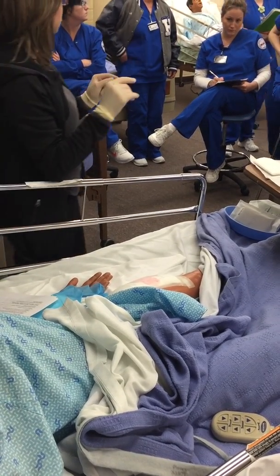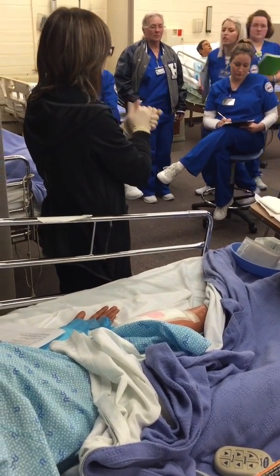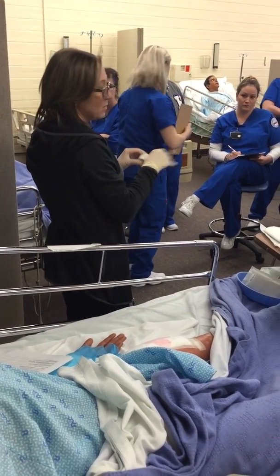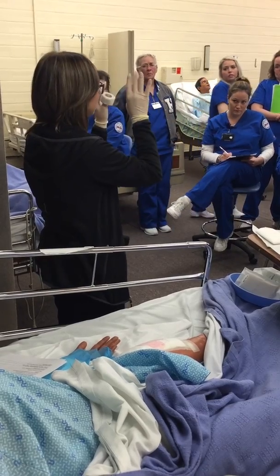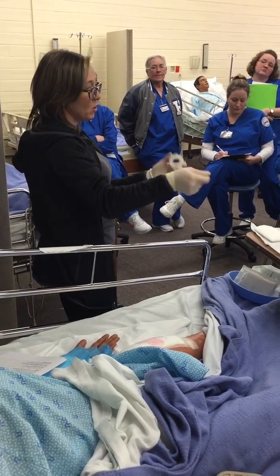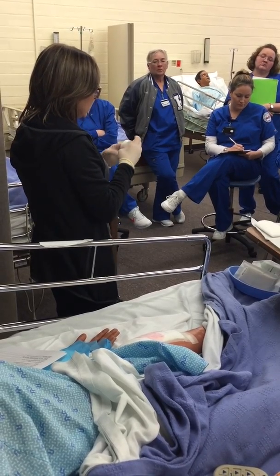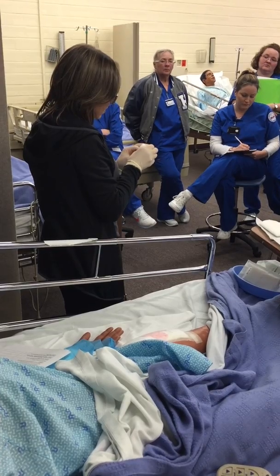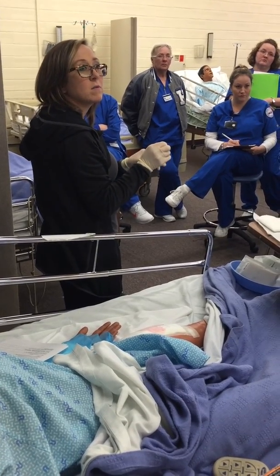Are those sterile gloves or clean gloves? They're clean, not sterile. I just never took my gloves off, because I didn't want to mess with them. Right. Okay, I just want to make sure. The whole time I'm prepping this, I can prep it with my hands. So you can do it with your hands because it's sterile. You're opening and prepping all your sterile stuff. Or if you want to put gloves on, you can put gloves on. It's up to you.